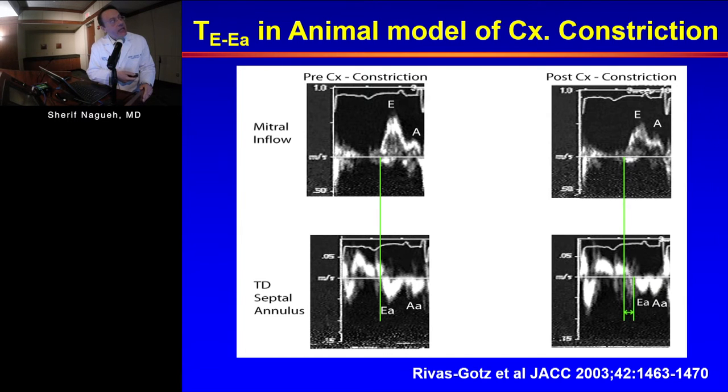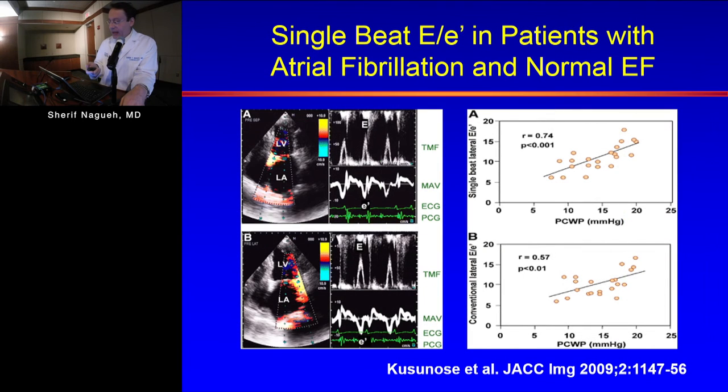This delay in the annular early diastolic velocity results in the velocity taking place when there is the diastasis period, equal LA and LV pressures, and therefore it is not affected by the absolute LA pressure value or absolute LV pressure value. It's an early event though. What? Diastasis is later than. Correct. So E happens earlier, but longitudinal expansion is delayed.